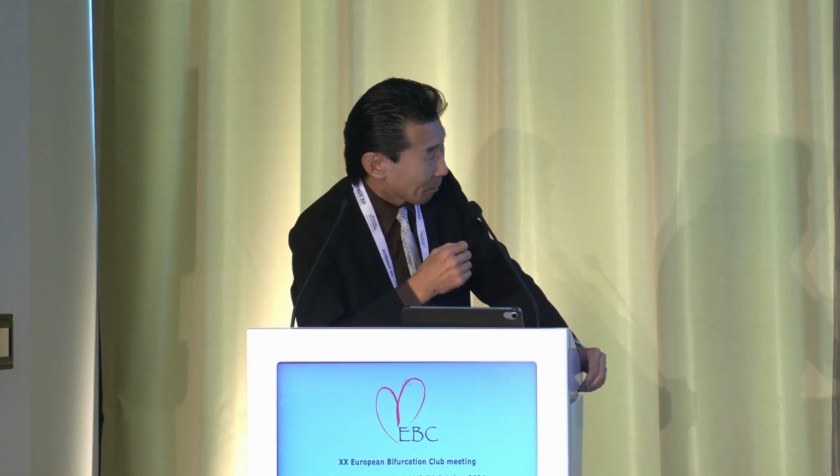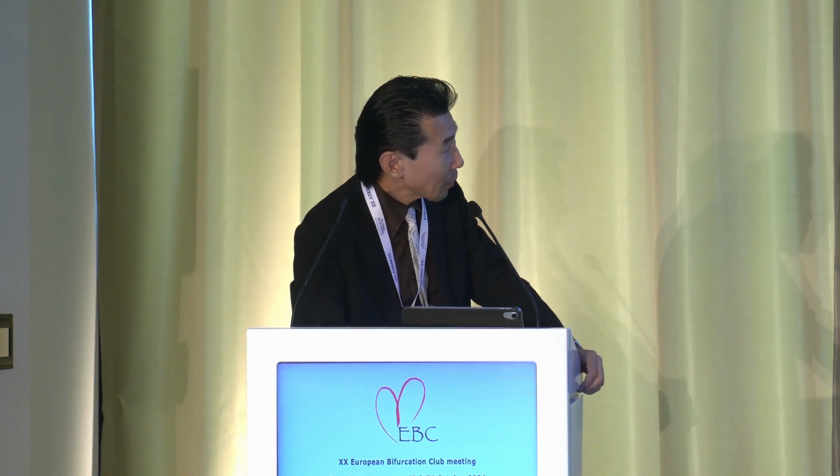Thank you very much. I had one question. Your wire bias could also be determined by just watching the IVUS contact, isn't that true? If you get through a lesion with the IVUS, you can have a very quick assessment of your wire bias.